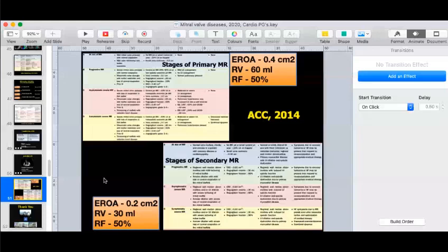Thank you. Now, the problem has been that the methods which are used are the ones which are causing problems. When we look at the effective regurgitant orifice area, how do we arrive at this? We use the PISA method to look at the EROA. Now, the PISA is very reasonably reliable in a primary MR. The reason is the orifice shape is more or less circular. And when you have a primary MR, especially in rheumatic heart disease, it is going to be fixed, it is not going to change because the leaflets are already diseased and fixed.